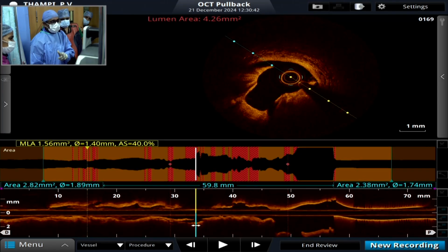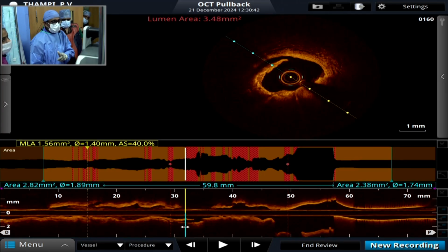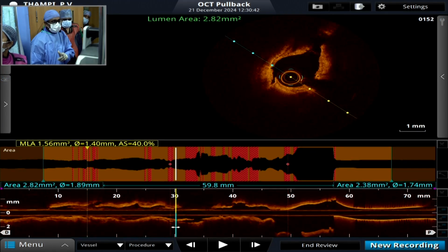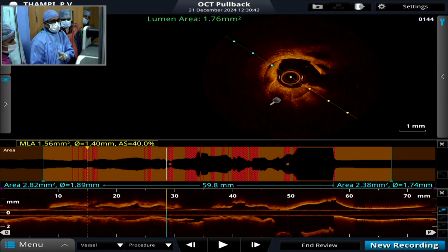The calcified nodule is seen at 5 o'clock position. At 11 o'clock position, you are seeing a calcium that has been shaved off, that's smoothened out. Now here again you are seeing a small fracture over here, and the dissection and the fracture. Then again here the volume reduced area, the calcium nodule wherein it has been shaved off.